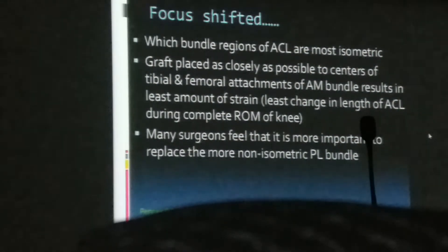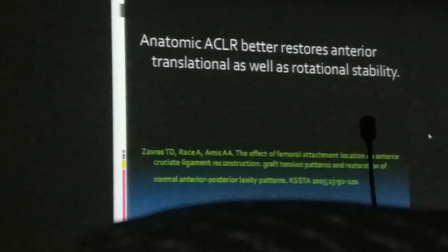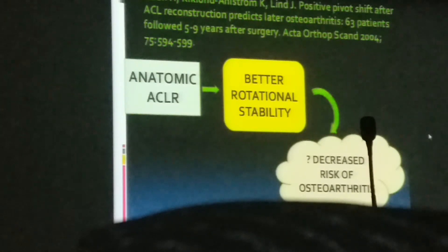Which ACL bundle is more isometric remains controversial — some say the AM bundle femoral-tibial attachment has least strain; others say the PL bundle is more isometric. The field has shifted from isometric to anatomical tunnel placement. Placing the femoral tunnel inside the anatomical footprint of the ACL results in knee kinematics closer to the native ACL compared to the isometric technique, controlling both AP and rotational stability and reducing the risk of future osteoarthritis.